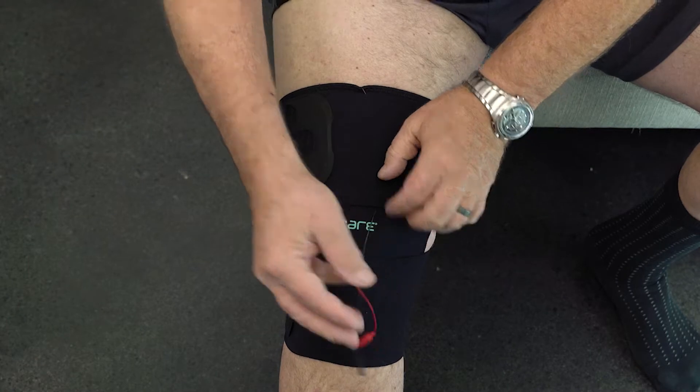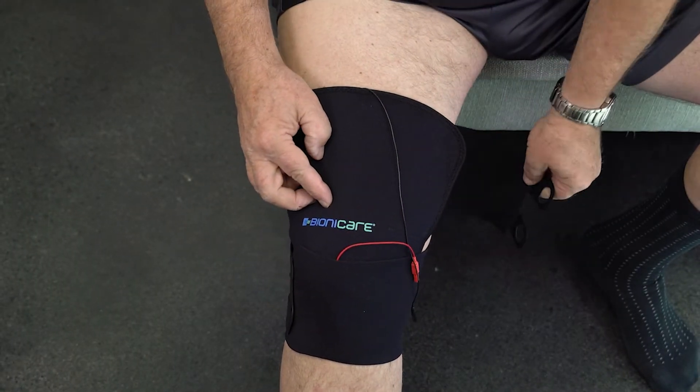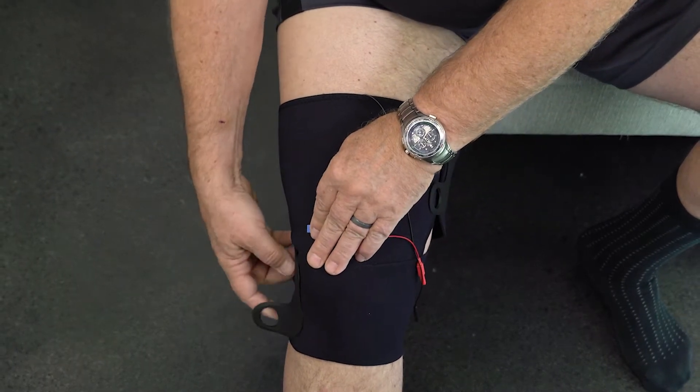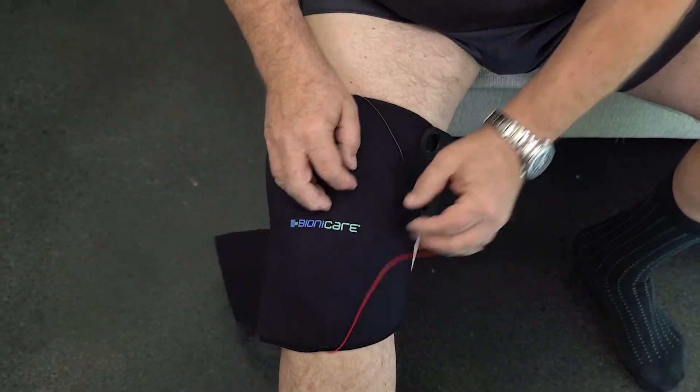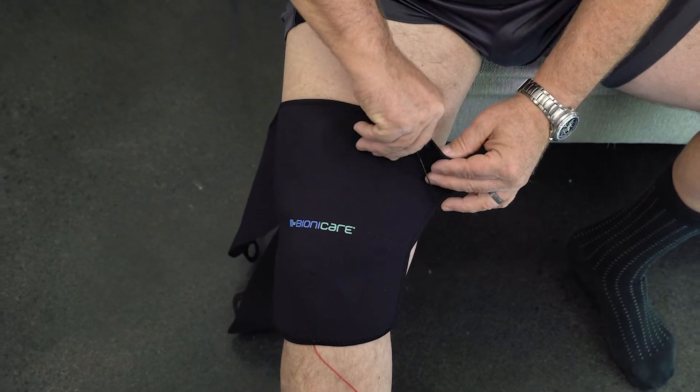Unwrap the Bionicare wrap and carefully peel the wrap and electrodes off the leg. The electrodes can stay on the wrap for your next treatment.